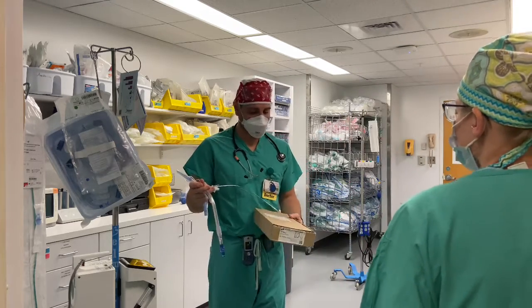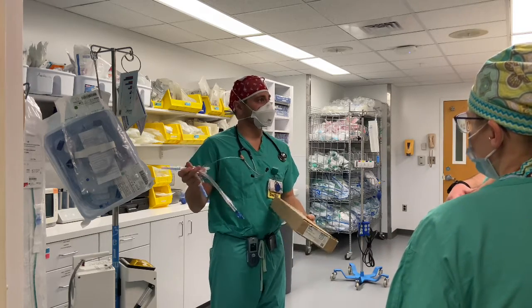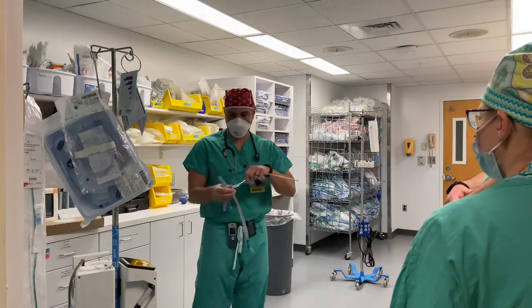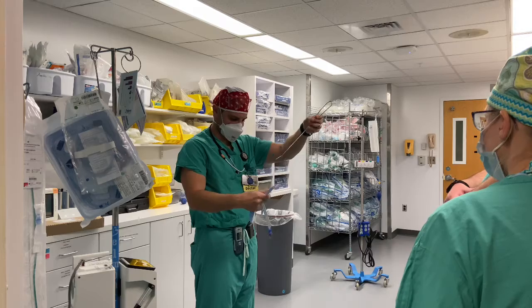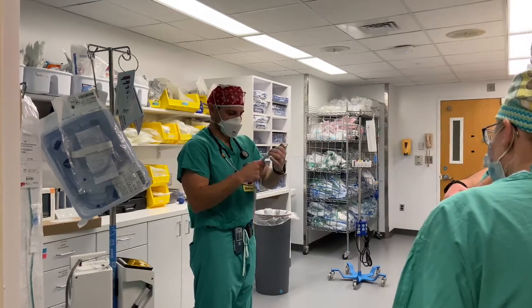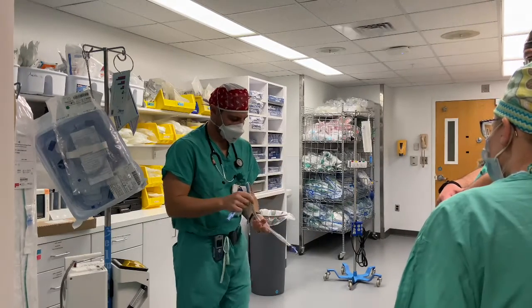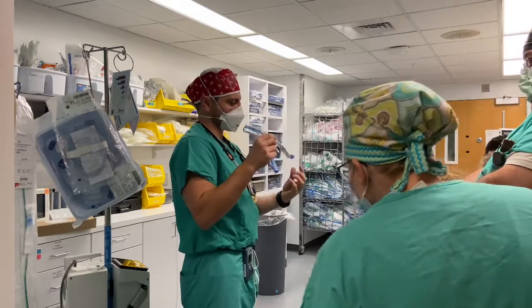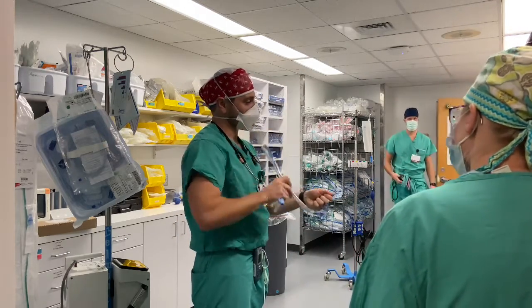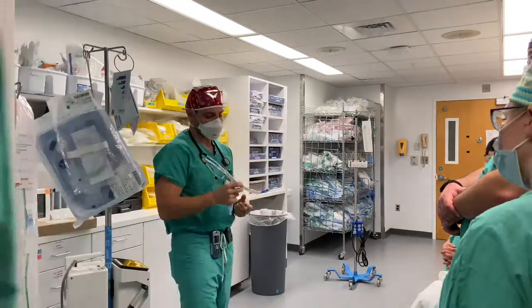I never use the smaller ones, but the size is the first thing, and then choosing which side you want to use, right or left. So this is styletted. Take it out of the box. The stylet is going to go down the bronchial side because that's the most distal port on this thing. It's the one that goes furthest down into the airway. And it's got this natural curve at the end, but you'll see most of us exaggerate it a little bit because these are big tubes and it's sometimes hard to get it into the mouth where you actually want it to be going towards the vocal cords.